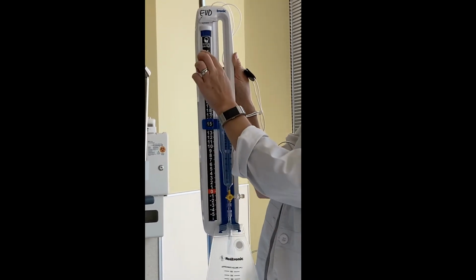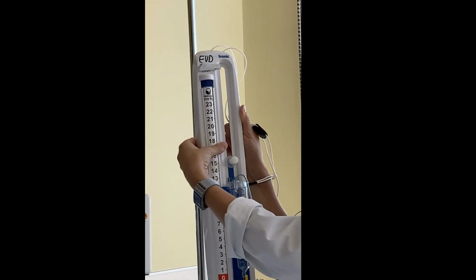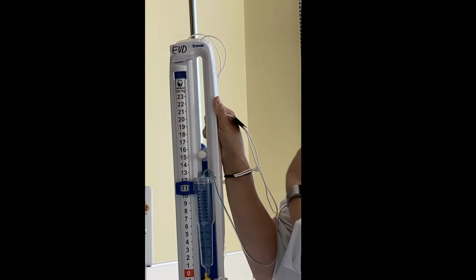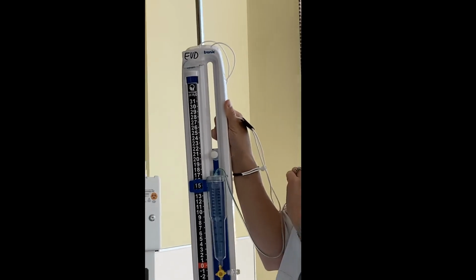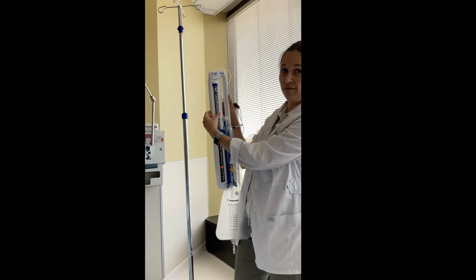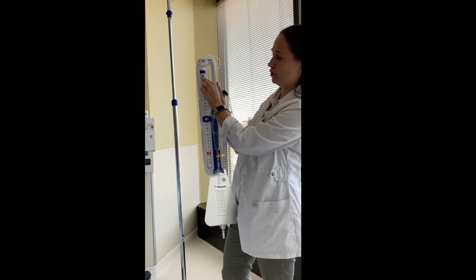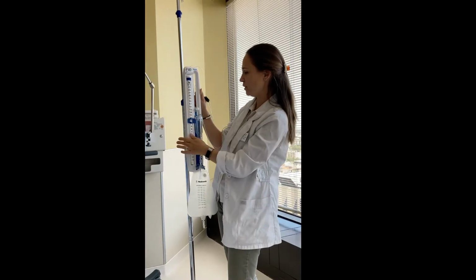Okay, you will also notice that here it's centimeters of water, and you can also have ventricular drainage in millimeters mercury. So all of these measures you can change when you set up your system. Normally, when we're setting up our EVD for ventricular CSF drainage, we will set it up to ventricular millimeters mercury. Okay, so I'm going to keep it there.